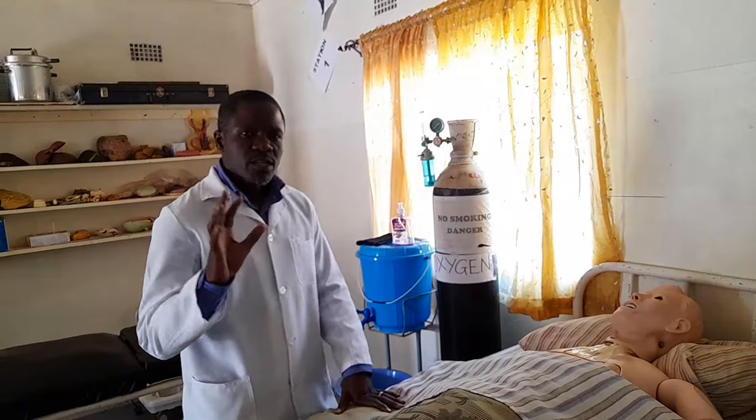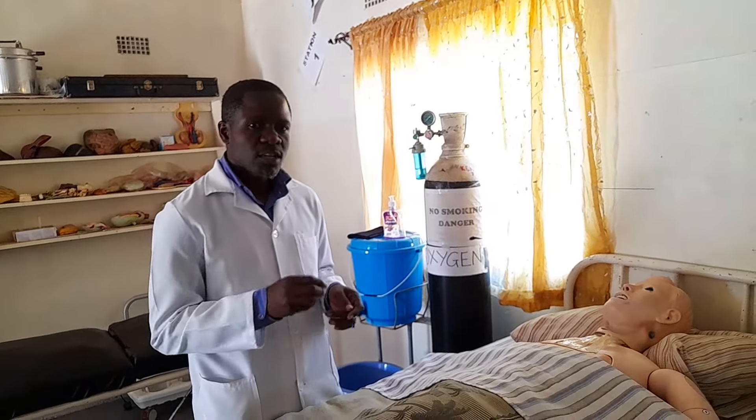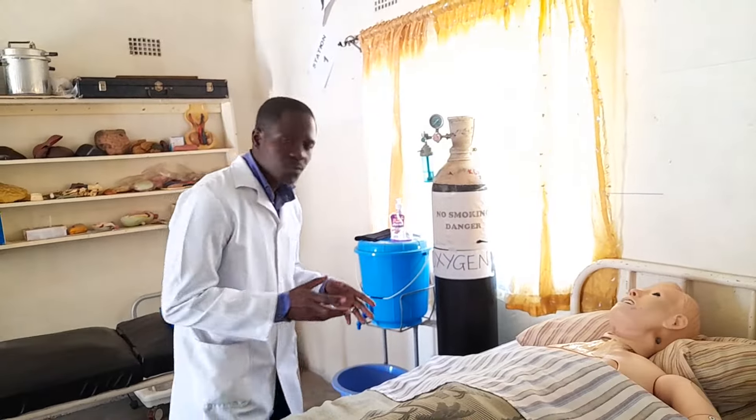Hello guys, today I want to do an OSC demonstration of how you can administer oxygen to a patient who is unconscious. Under OSC you only have five minutes in which you're supposed to perform, so we're going to do everything in a fast manner so that you're able to administer oxygen.